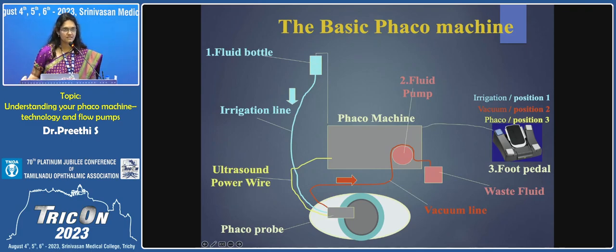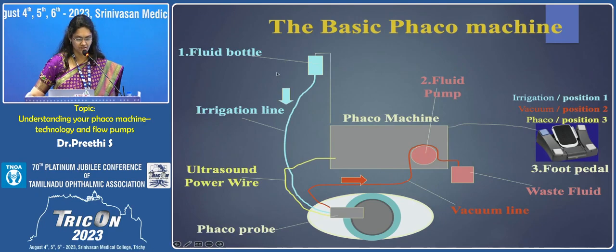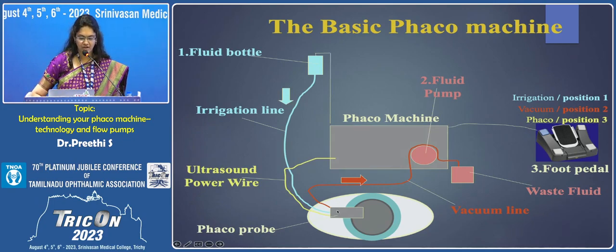This is the basic schematic representation of a Phaco machine. You have a console. The console has the fluid pump. And then you have the irrigation fluid outside the console. You have an irrigation line which is connected to the Phaco handpiece. The ultrasound power from the console is also directed to the Phaco handpiece. And from the Phaco handpiece, you have the aspiration line going out into the fluid pump. All the controls are connected through the foot pedal, which is also anchored onto the console. And this is the Phaco handpiece inside the eye.